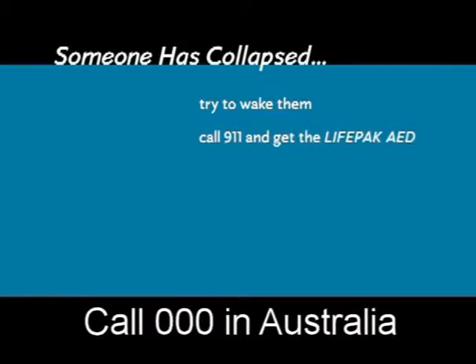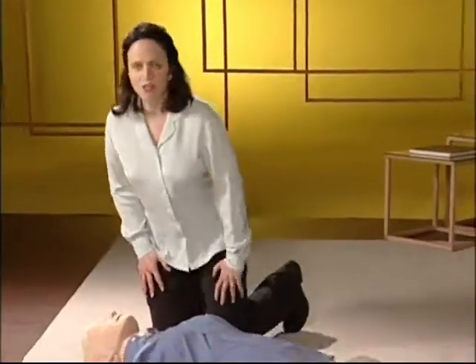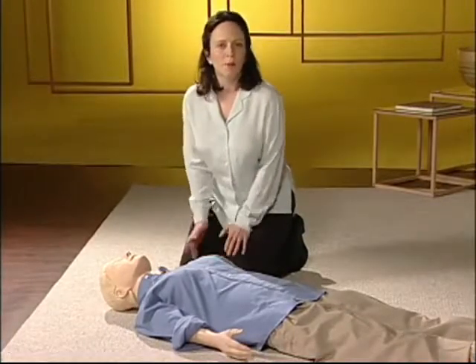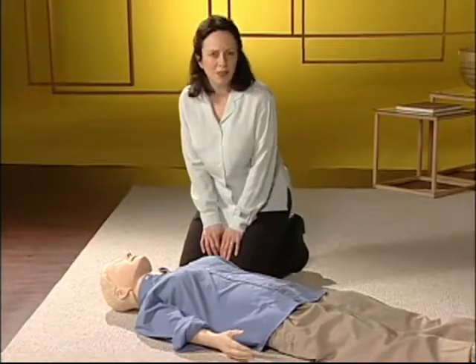If you see someone collapse, or you find someone already collapsed, first, try to wake them. If they don't respond, call 911 and get the Lifepak AED. Open the airway and check for normal breathing. Someone in cardiac arrest is unconscious and not breathing normally. They might not be breathing at all, or they might be gasping, or making what seems like snoring.